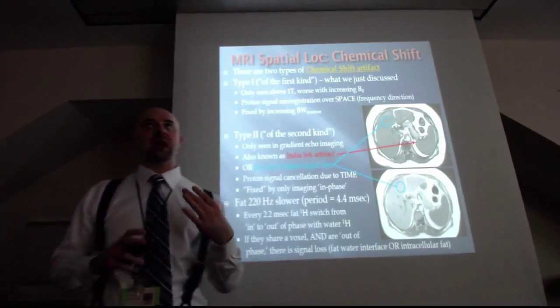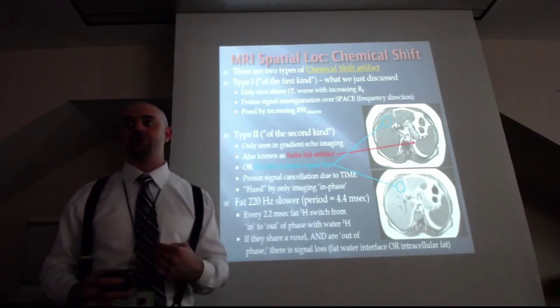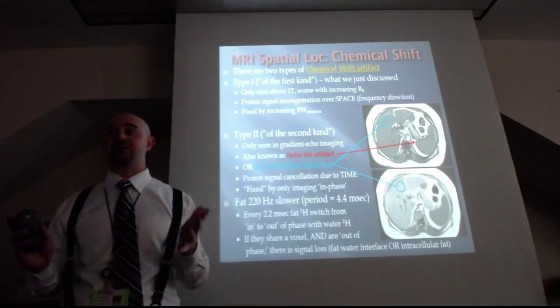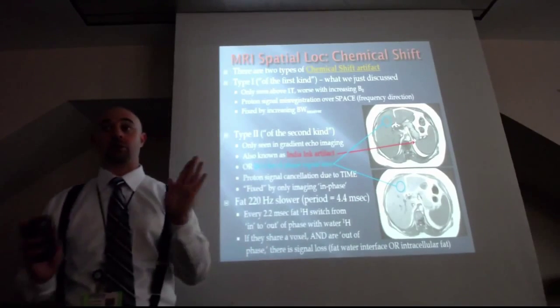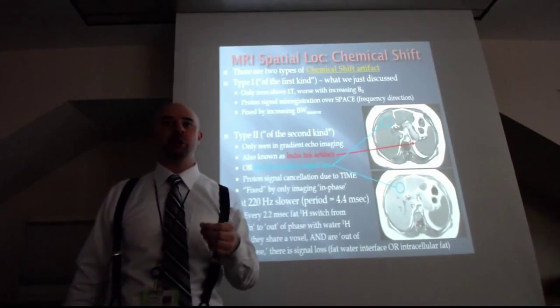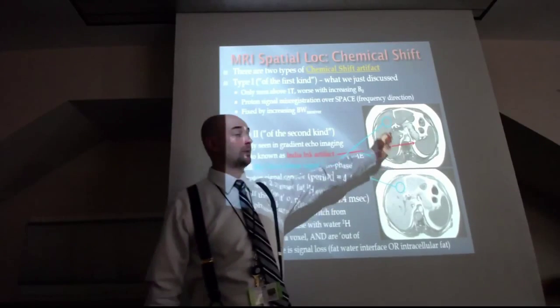And whenever you have both fat and water within the same voxel, if they're out of phase, their magnitudes are going to cancel. So you're going to get massive signal drop. Because when we do image, this is talk for later, but we only image absolute values of magnitude, right? So if there's a discrepancy, then that's why it looks black, because it's getting closer to 0 because the signals are canceling each other. So at any fat-water interface, there's necessarily a place where the voxel spans the two spaces, one of which contains fat, one of which contains water. That's going to look really black.